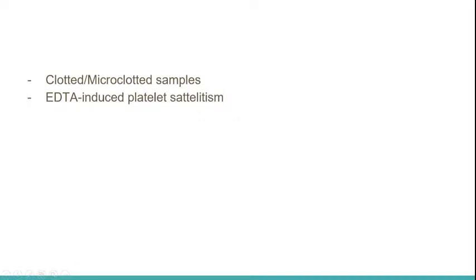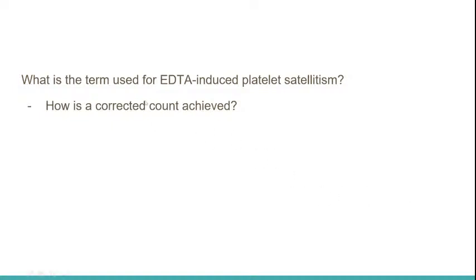But there's a certain way for us to correct the platelet satellitism, and by the way, EDTA-induced platelet satellitism is also known as pseudothrombocytopenia.